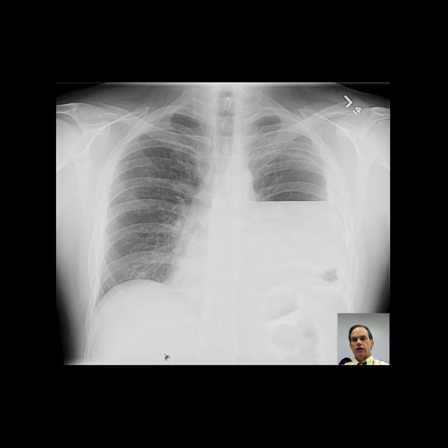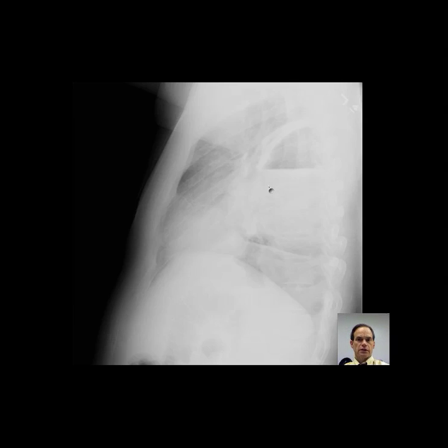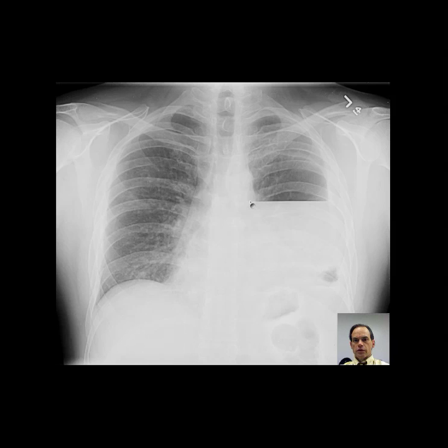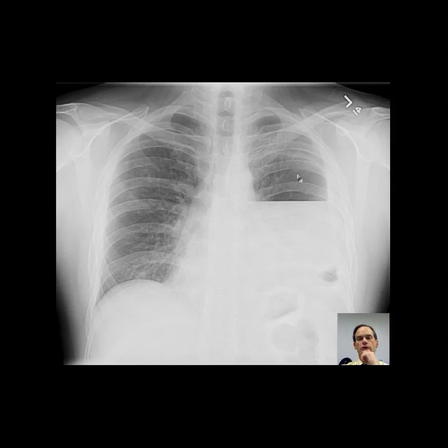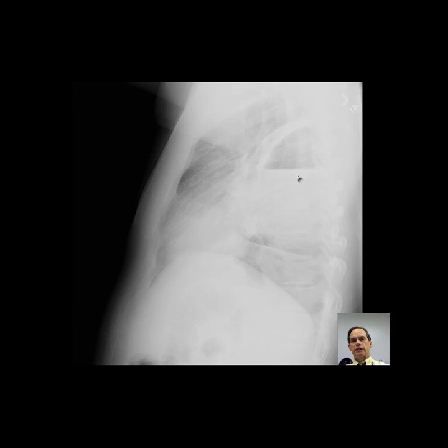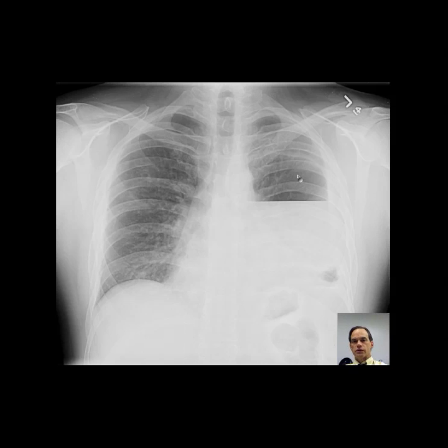There is an air fluid level in the left hemithorax. The lateral view suggests the air fluid level is located posteriorly. There is a greater degree of width to this air fluid level on the frontal view compared with the AP diameter on the lateral view. The findings suggest this is most likely a pleural fluid collection with air fluid level.